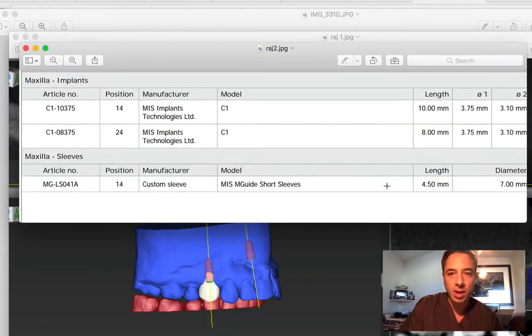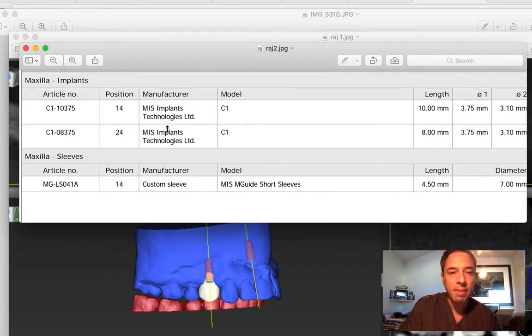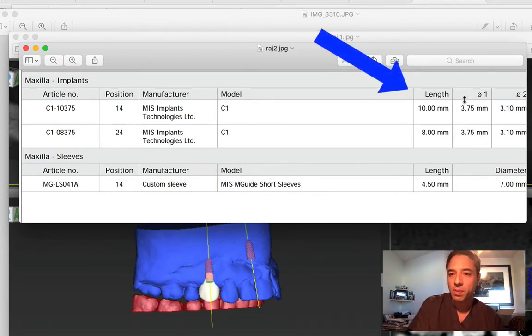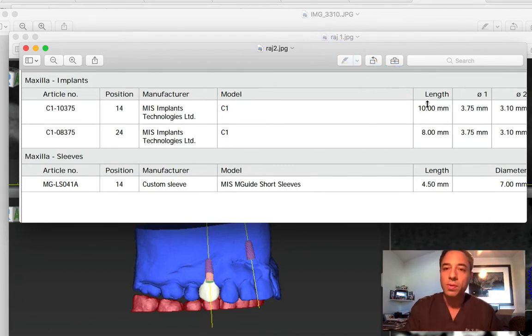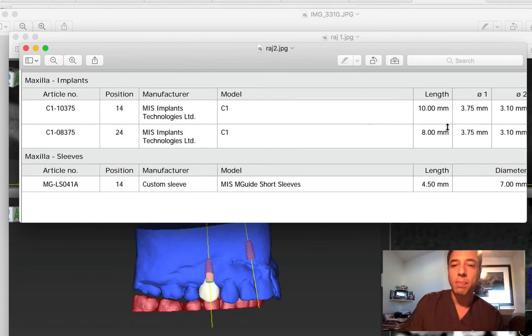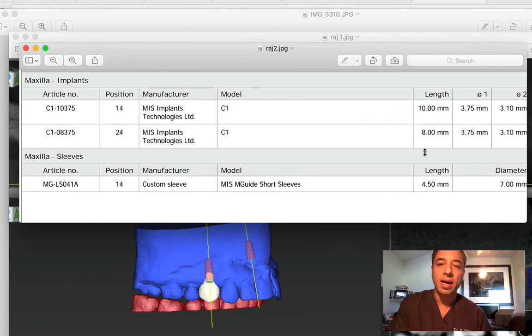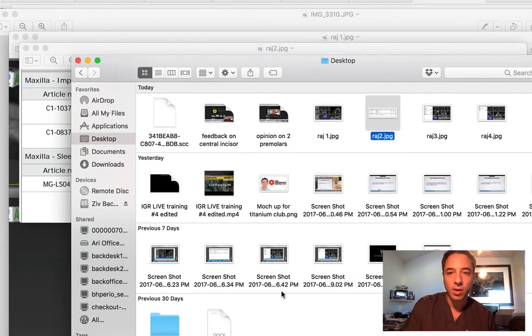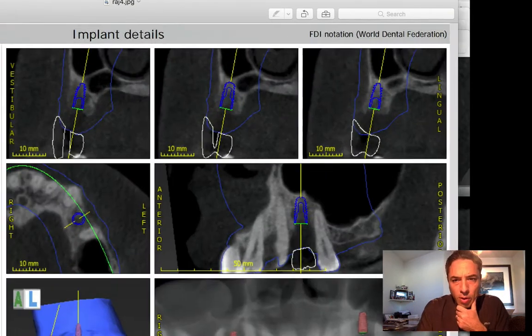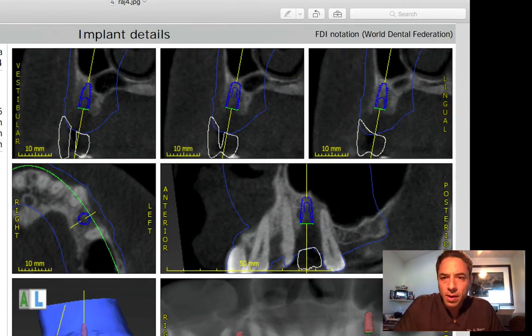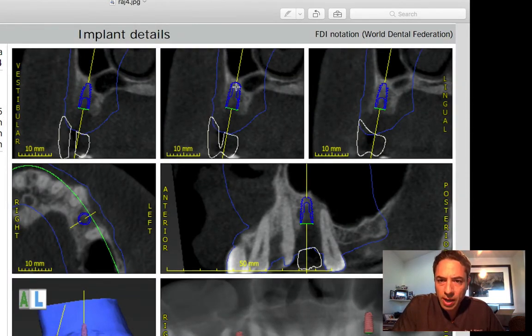You sent me also the implant dimensions that look very reasonable in terms of diameter. 3.75 for a premolar is good. One is 10 millimeters on the upper right hand side, the other one is 8 millimeters. So the premolar on the upper right hand side — the positioning is great.